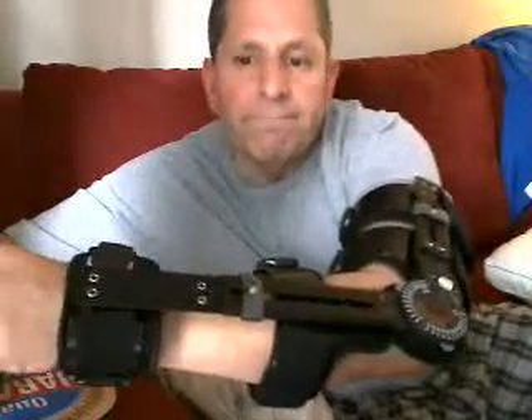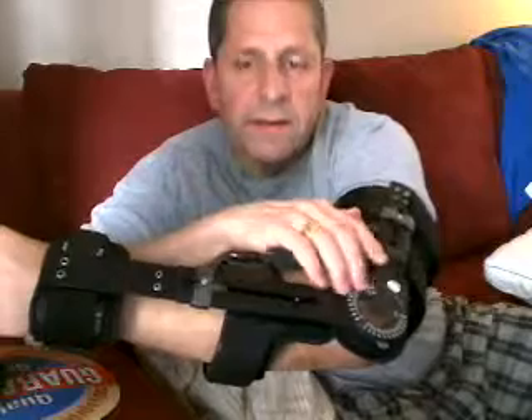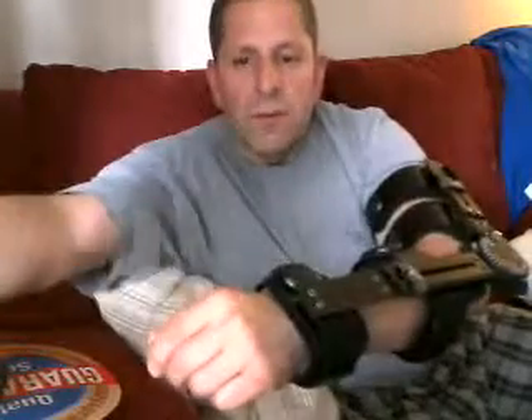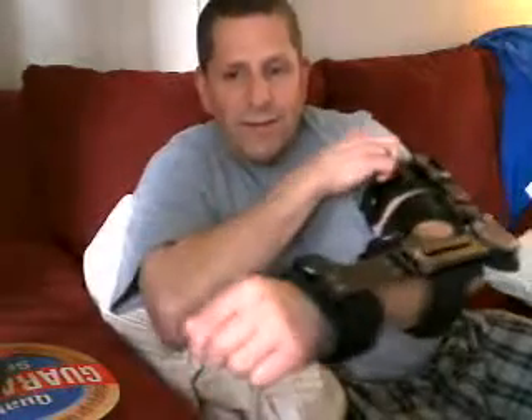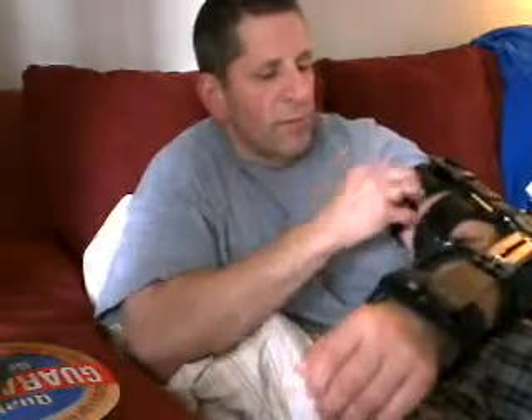I'll get up close to the screen here — this is what I was talking about. It's locked in place with this dial thing here, and eventually I'll be able to stretch it all the way like that, but right now I got to keep it like this. It's awkward — it's one of those can't really get a shirt over it situations.